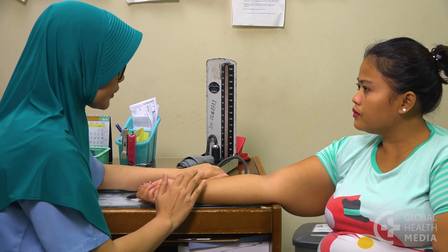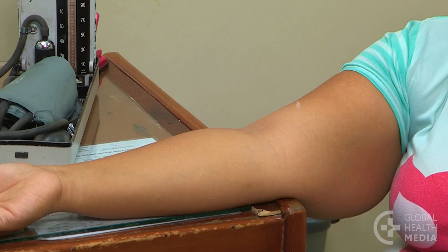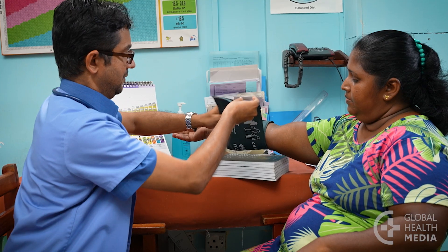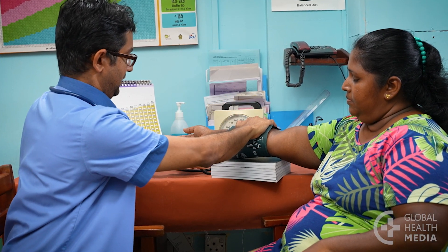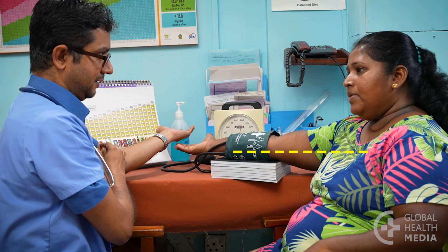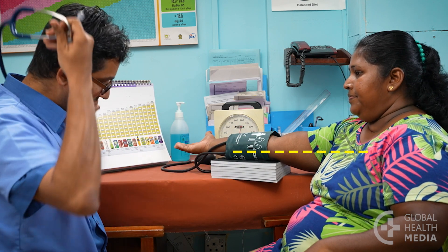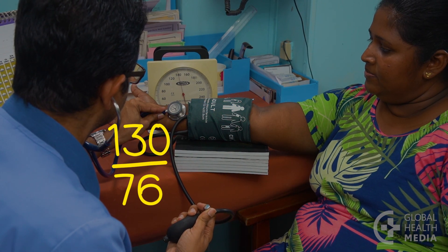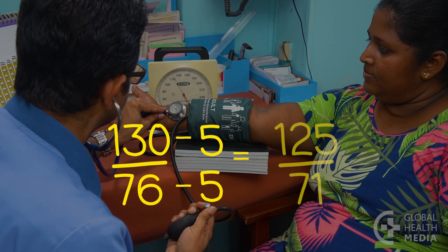If your upper arm is large — more than 34 cm around — a reading with a normal size cuff will not be accurate. Instead, you can place your cuff on your forearm, also at the level of your heart. The forearm method may give a higher reading, so subtract 5 from the measurement.